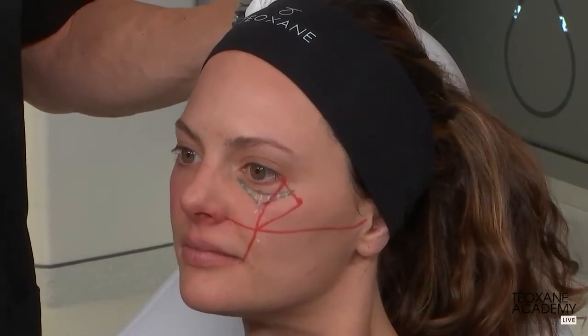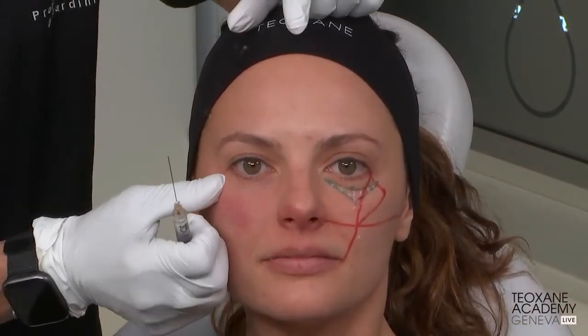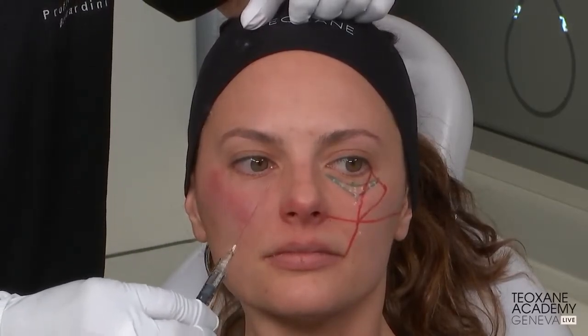She looks really treated. So to me, this is a very good example of how to treat indirectly the nasolabial fold. This is why I was explaining why it's so important to use those lines of ligament stretching, lifting, instead of filling, not too much into the defect itself. Usually injectors would place a 0.5 cc syringe right into there, hoping to stretch a ligament that is attached deep to the bone. So this is a little more difficult. By focusing on addressing the entire thing, you achieve a better, more natural result. You inject less product in the tear trough, so you would expect less complication, and you would be able to indirectly address the entire midface.